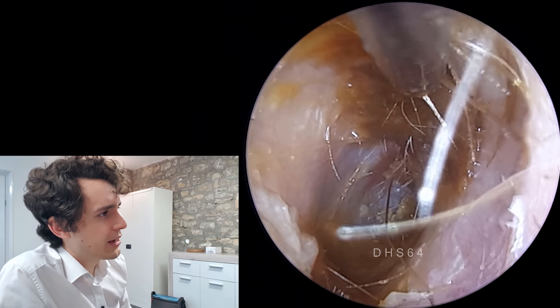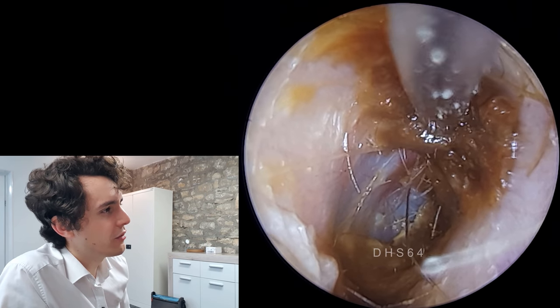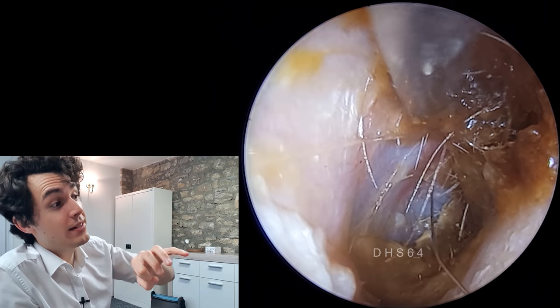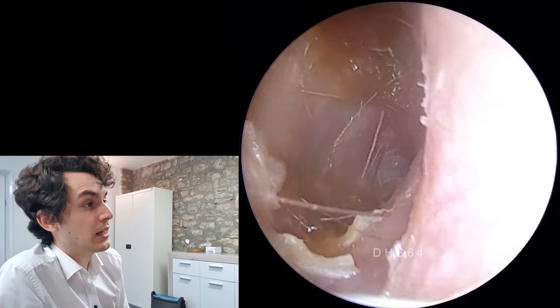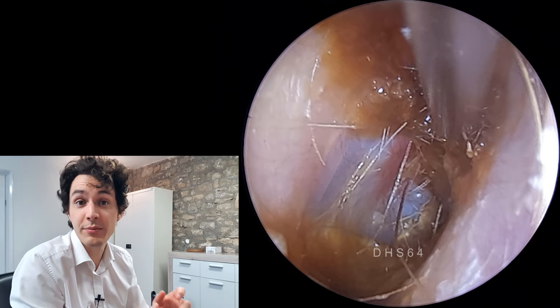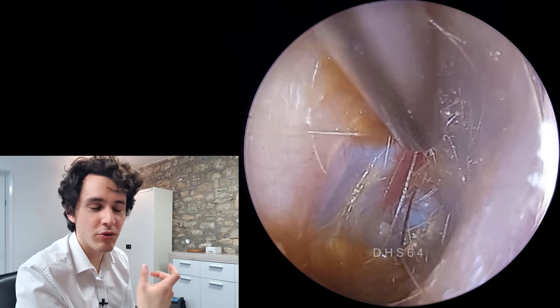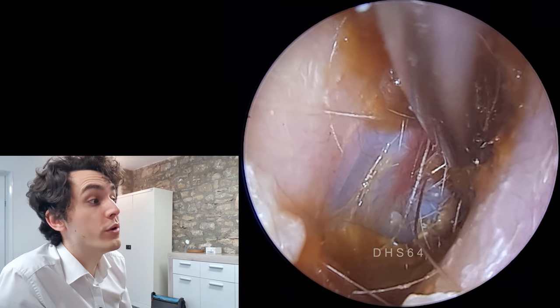We're just trying to get this top section, which is a bit difficult — primarily because it's in an awkward position. I'm right-handed, so whenever I'm doing suction I'm creeping the suction probe into the ear with my right hand, and therefore anything on the right-hand side of the canal is always a bit difficult to get. I'm not ambidextrous, and it's highly unadvisable to switch hands because with my left non-dominant hand I won't have nearly as much control over the suction probe — I'd end up applying too much pressure or not making much progress. So I always use my dominant hand.